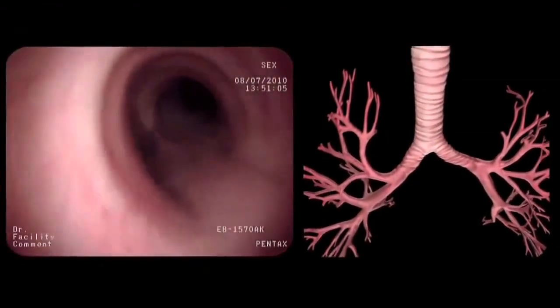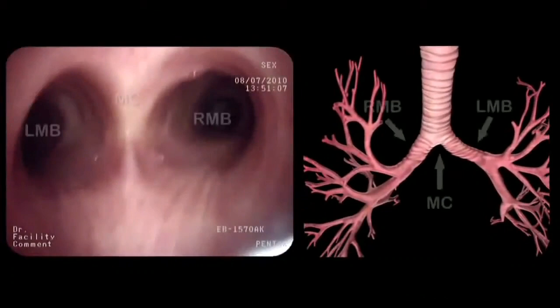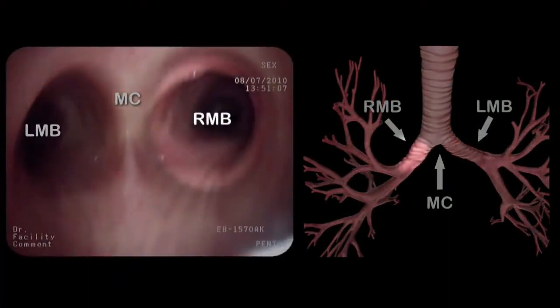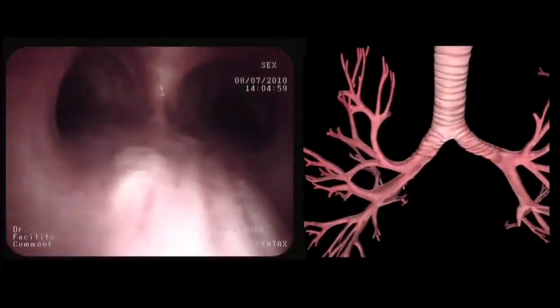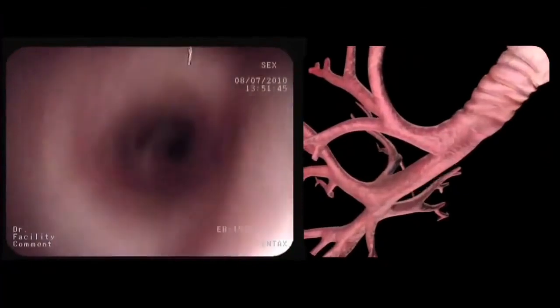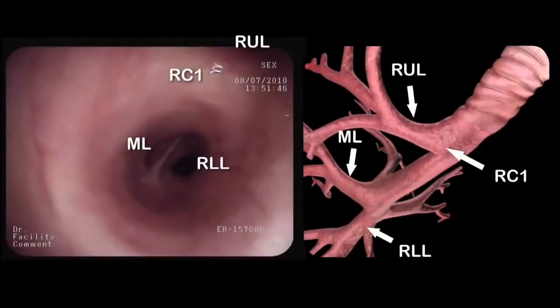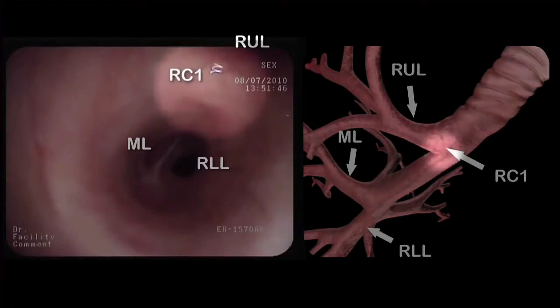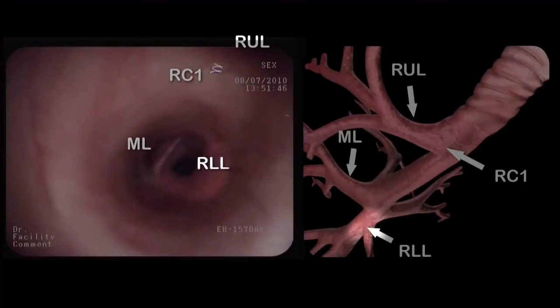Eventually, we reach the main carina where the left and right main bronchi originate. We then rotate the bronchoscope 90 degrees clockwise and enter the right main bronchus. At the end of the right main bronchus, we recognize several important anatomical landmarks: the orifice of the right upper lobe, the right carina 1, the orifice of the middle lobe, and the orifice of the right lower lobe.